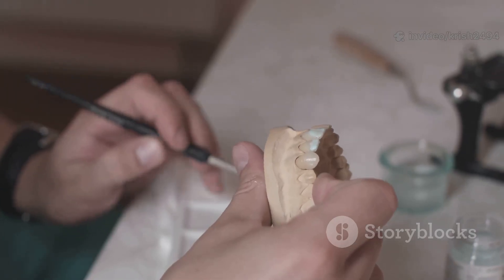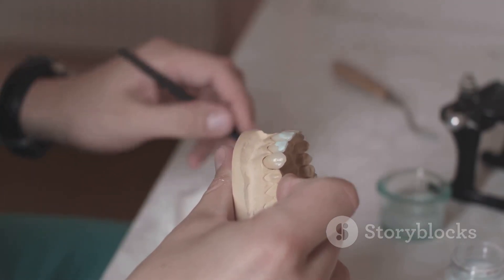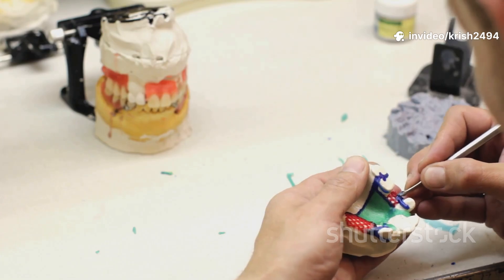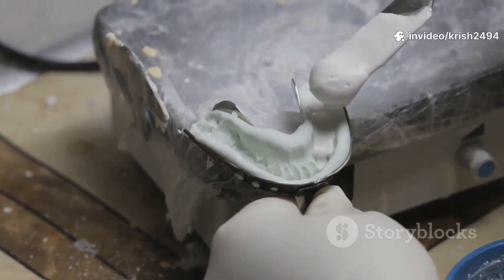Step 4 is the master cast and record base. The lab pours that final impression in high-strength stone to create a master cast. On top, they build a record base with a wax rim. This combo is what the dentist uses to figure out how your jaws fit together.